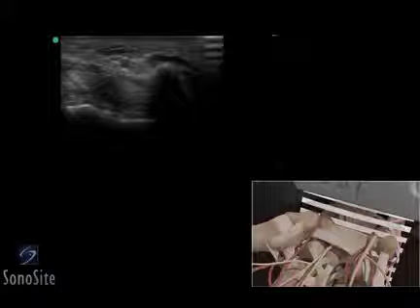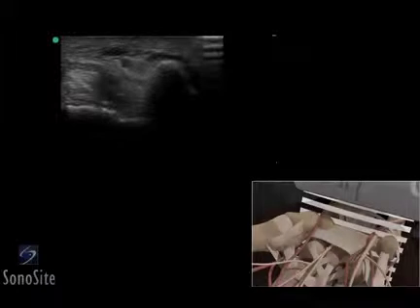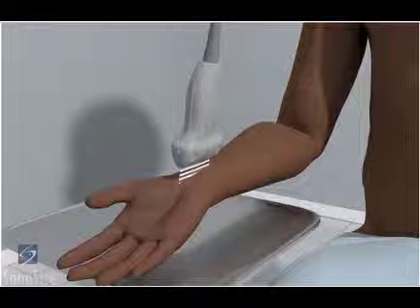A linear array transducer with a musculoskeletal exam type is used to perform an ultrasound examination of Guyon's canal. The patient is placed in a sitting position with the dorsal hand placed on an examination table.